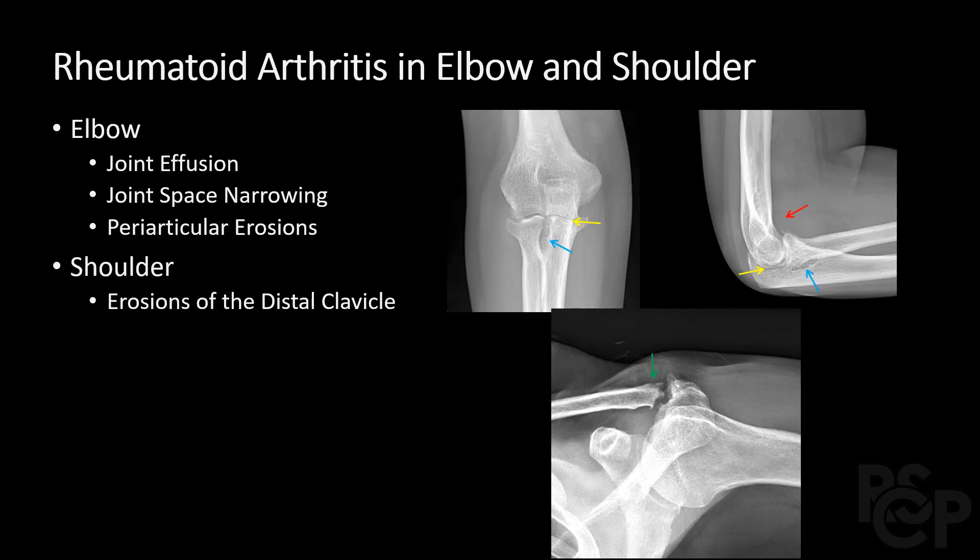Now I'm going to discuss rheumatoid arthritis in the elbow and shoulder. The red arrow represents abnormal soft tissue attenuation anterior to the distal humerus, consistent with a joint effusion. The yellow arrows show joint space narrowing, most pronounced involving the ulno-humeral articulation. The blue arrows show periarticular erosions, most pronounced involving the proximal radio-ulnar articulation. Finally, the green arrow shows erosions of the distal clavicle.